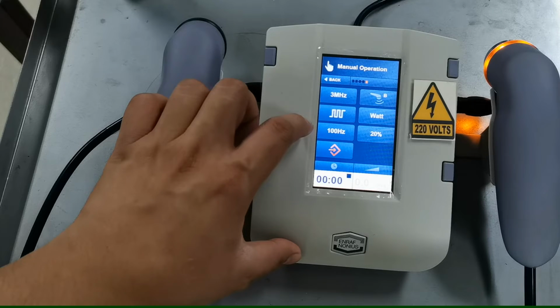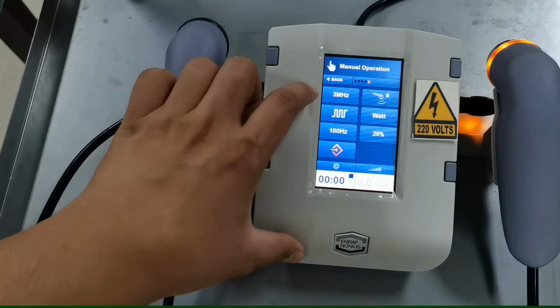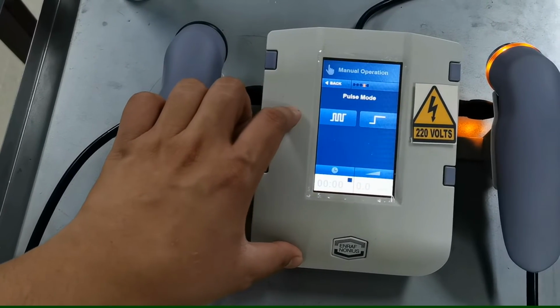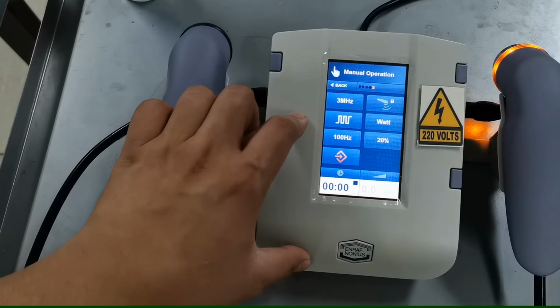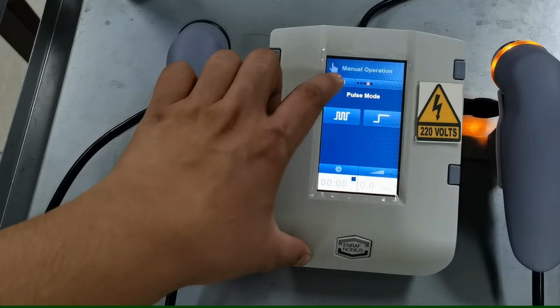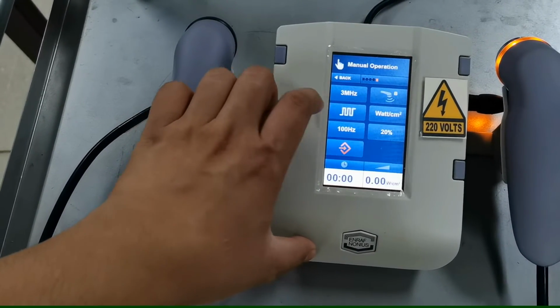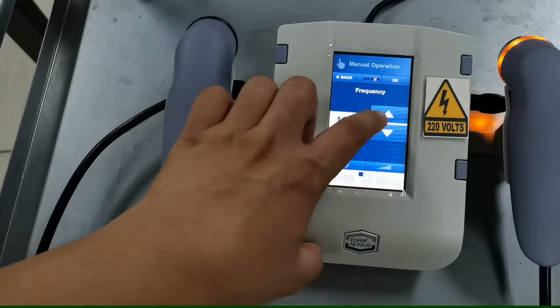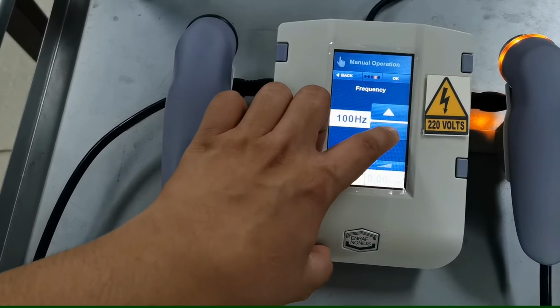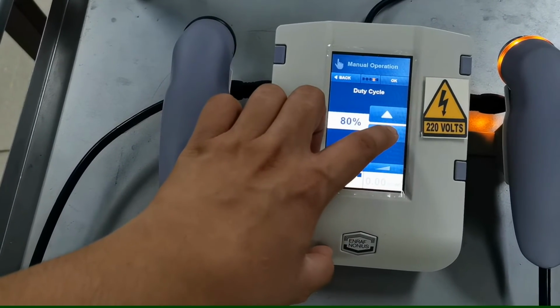So we have here the frequency, if it's pulse or continuous. The intensity. This would be the frequency. And this would be the duty cycle.